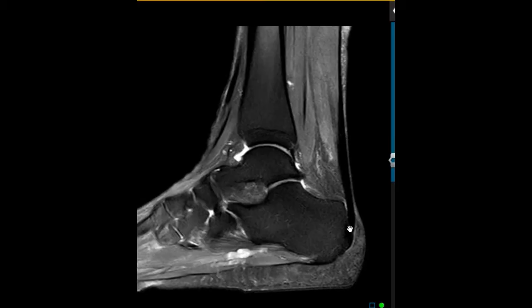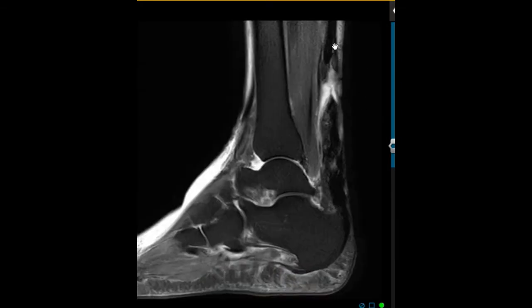It should be really low in signal. This is the soleus muscle blending in with the tendons. This is a normal Achilles, and this is a tear — so pretty straightforward. This is the Achilles tendon looking normal up high, and here is an area of fluid and hemorrhage where the tendon is separated.